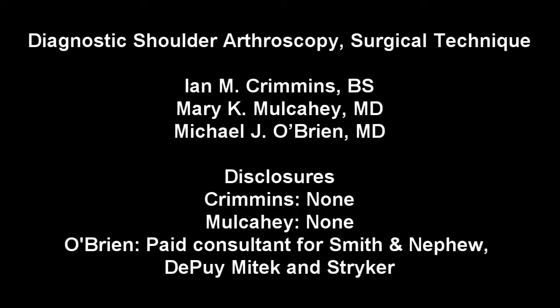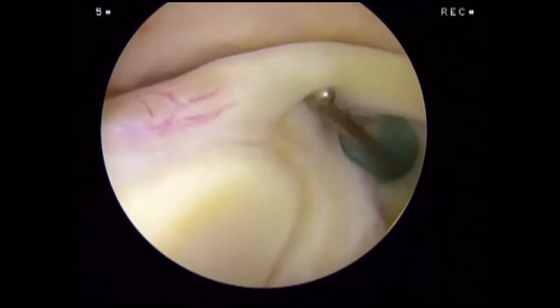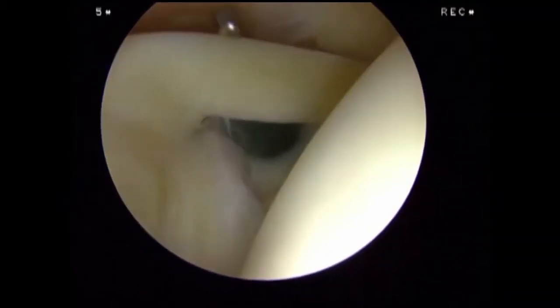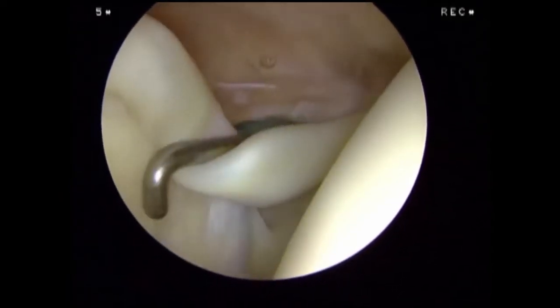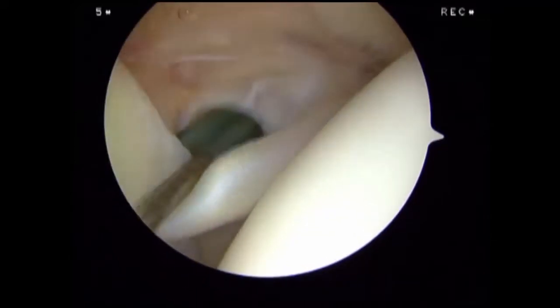We are performing a diagnostic arthroscopy in the beach chair position in a right shoulder. Looking anteriorly from the standard posterior viewing portal, we probe the long head of the biceps tendon at its attachment to the superior labrum. Probing the biceps assesses for biceps instability.